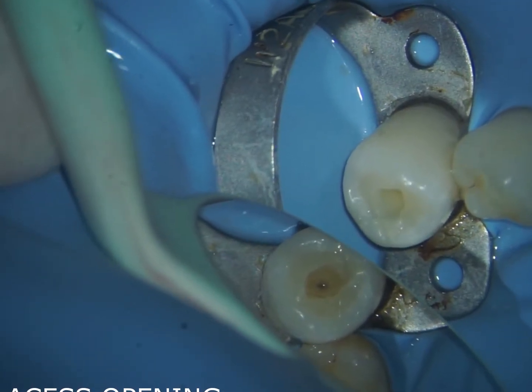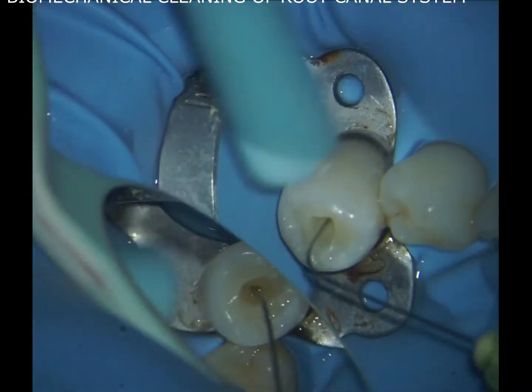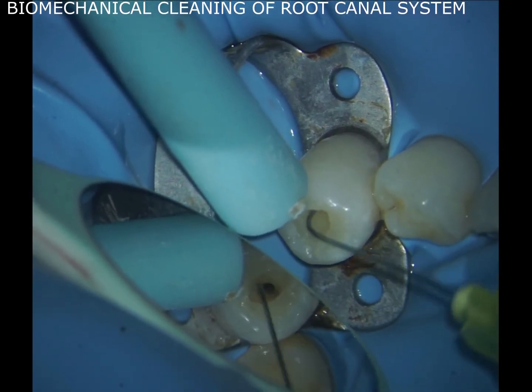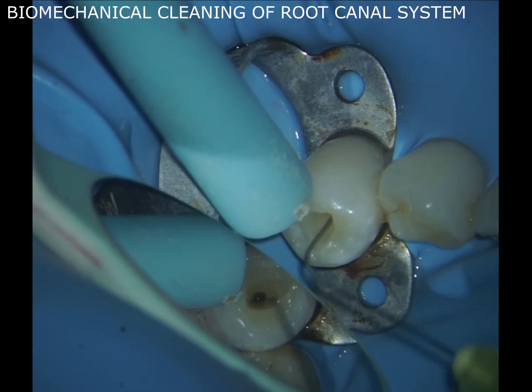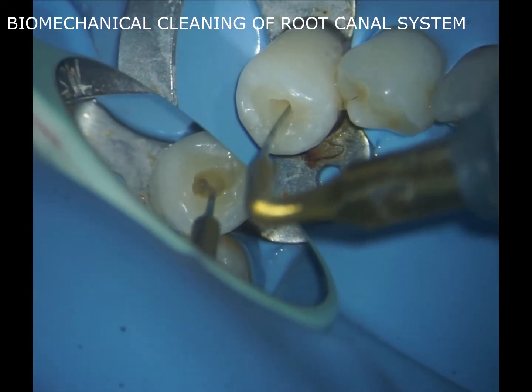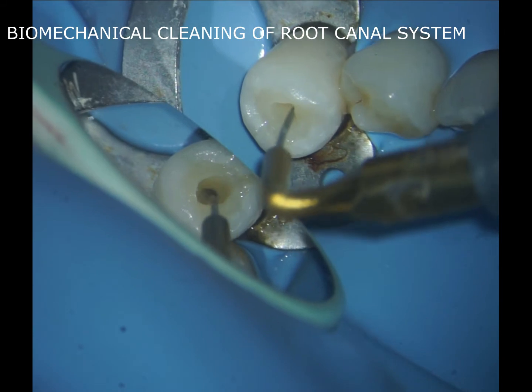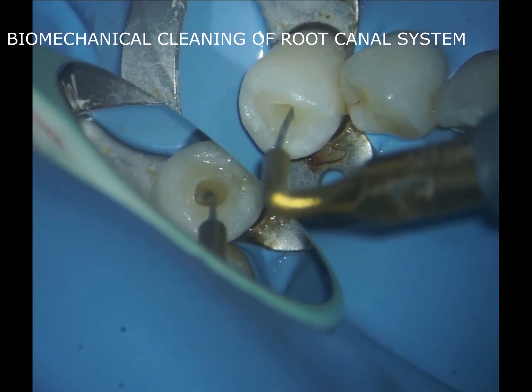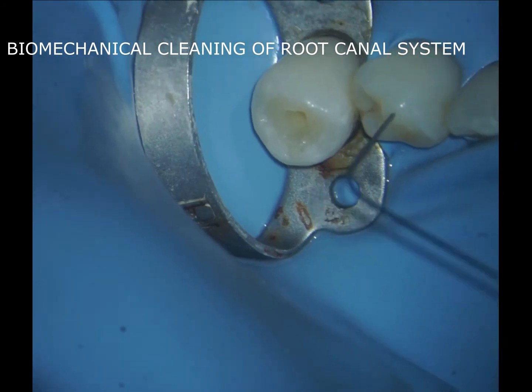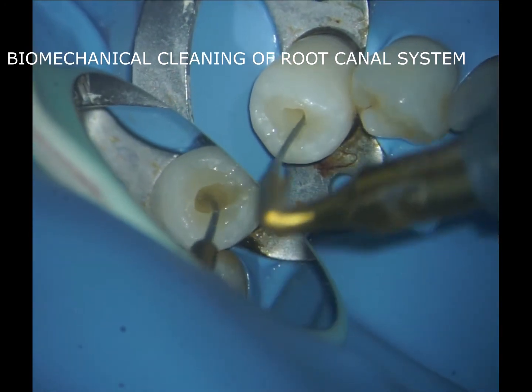Now we come to the second and most important step: biomechanical preparation or debridement of the root canal system. Instead of putting the file right away into the canal, I'm using lots of sodium hypochlorite at 5.25% concentration, trying to clean as much debris as possible. I'm using an Ultra-X ultrasonic device which activates the hypochlorite and helps in cleaning the root canal system. In a non-vital tooth, we need to clean the coronal portion of the root canals first to reduce chances of pushing debris through the apical foramen and causing flare-ups.